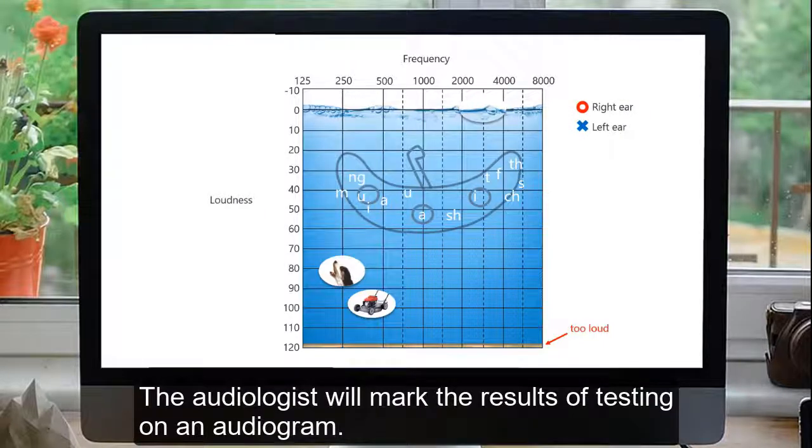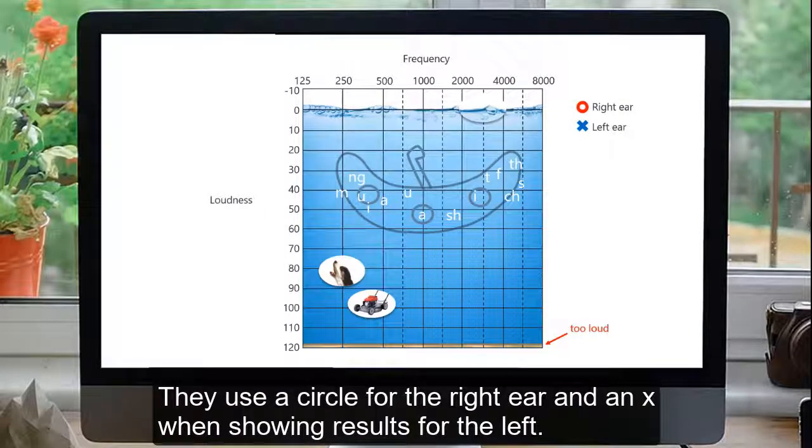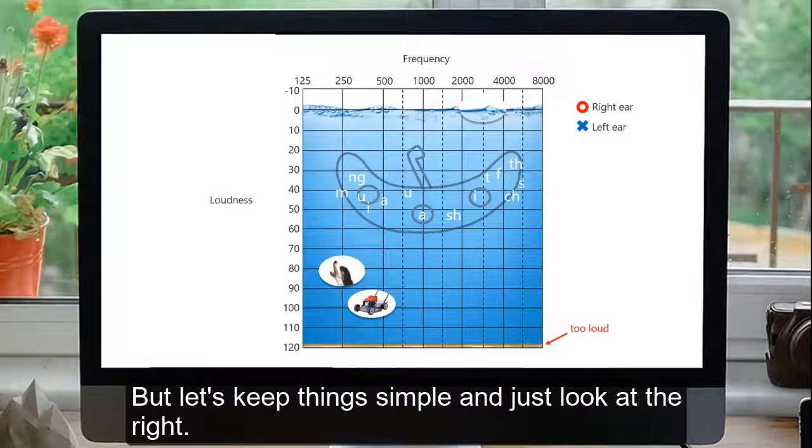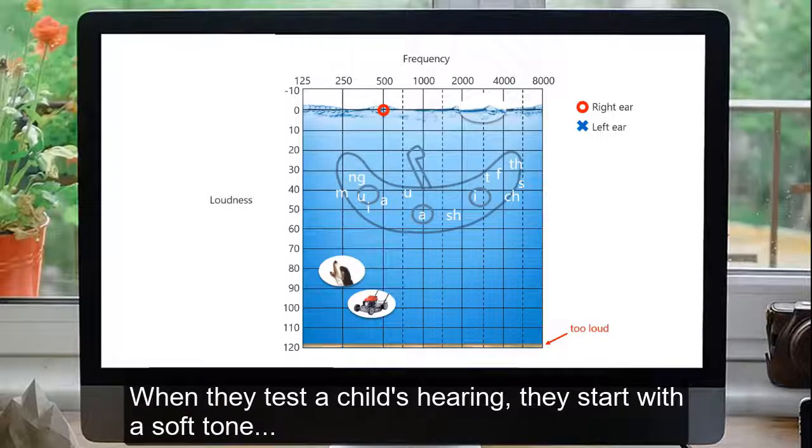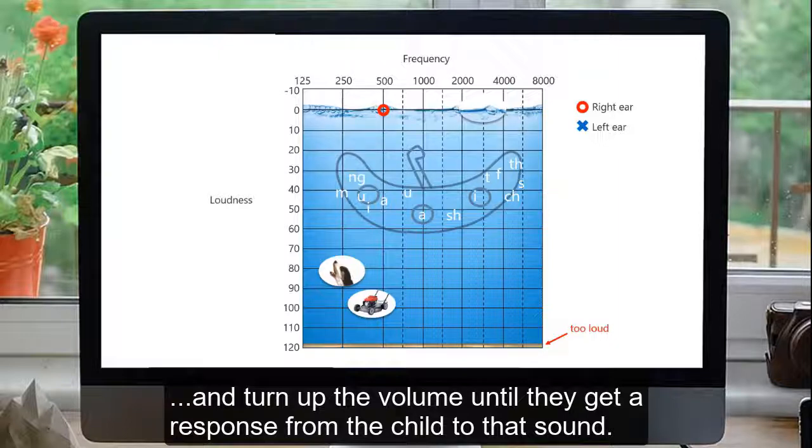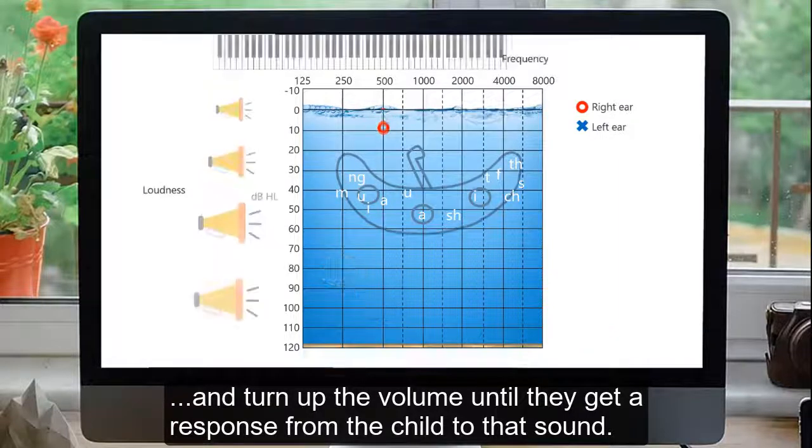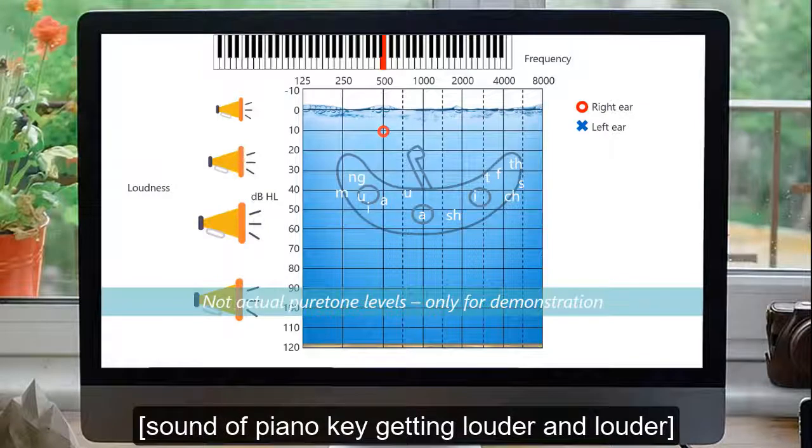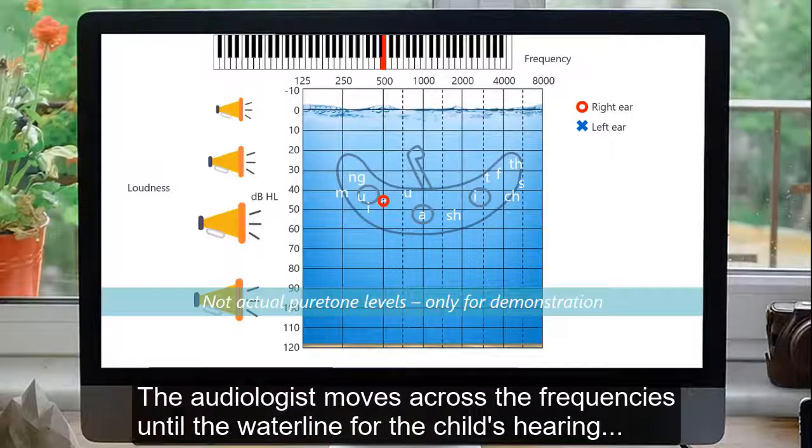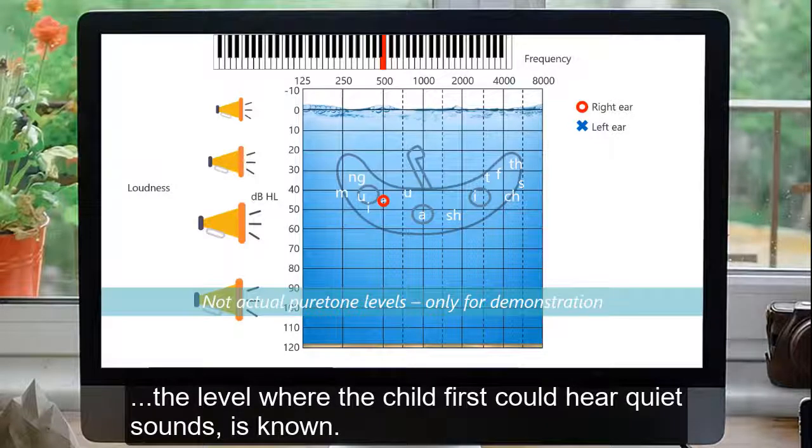The audiologist will mark the results of testing on an audiogram. They use a circle for the right ear, and an X when showing results for the left. But let's keep things simple, and just look at the right. When they test a child's hearing, they start with a soft tone, and turn up the volume until they get a response from the child to that sound. The audiologist moves across the frequencies until the waterline for the child's hearing, the level where that child first could hear quiet sounds, is known.